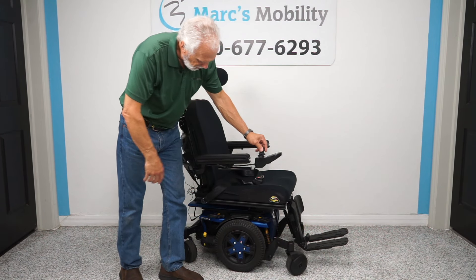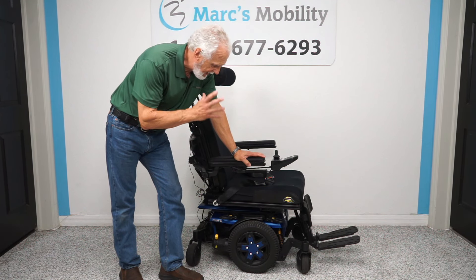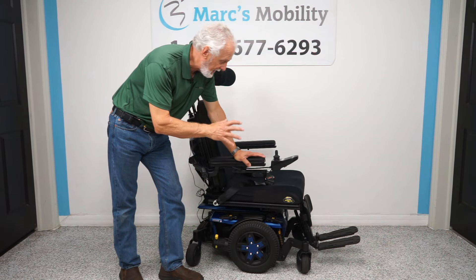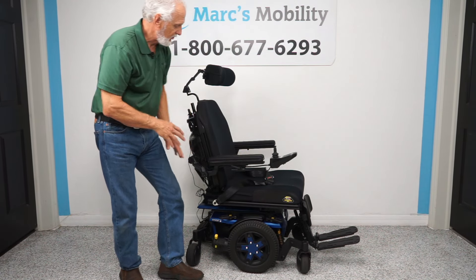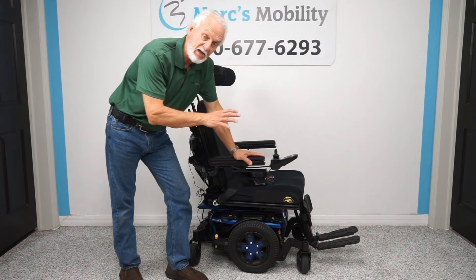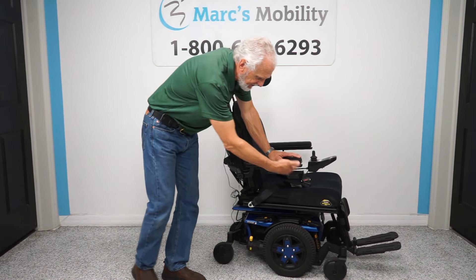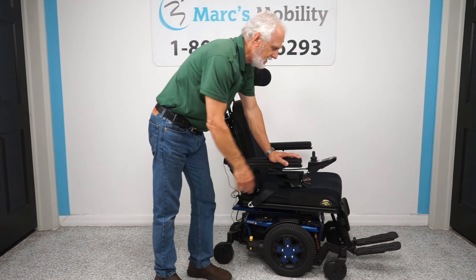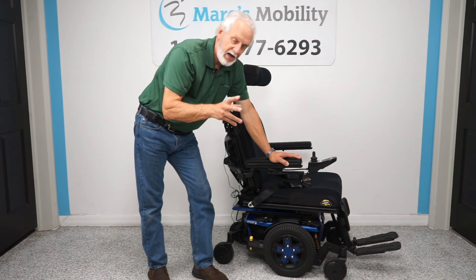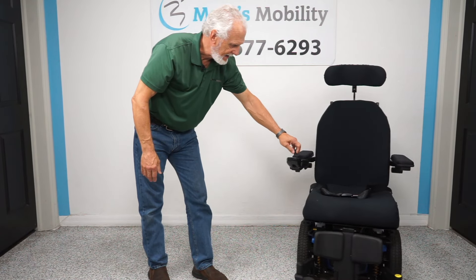Let me recap. This is a Quantum Edge 3 power chair, the latest technology from Pride Mobility — a high-end power chair. It does have 493 miles but everything looks new: the arms, cushions, headrest — it looks like it was completely redone. It has electric tilt, suspension, solid tires all around, anchor points, and flip-up footplates. If you just need the electric tilt and don't want to spend a lot, this may be what you need — it runs like it's brand new.